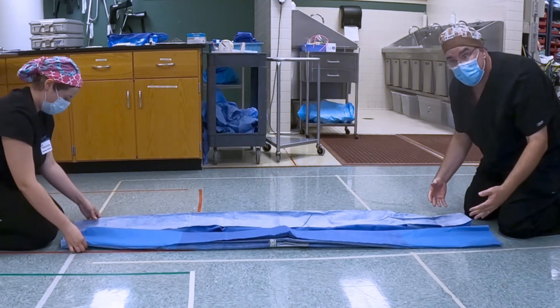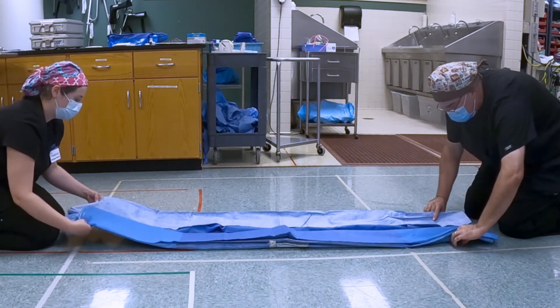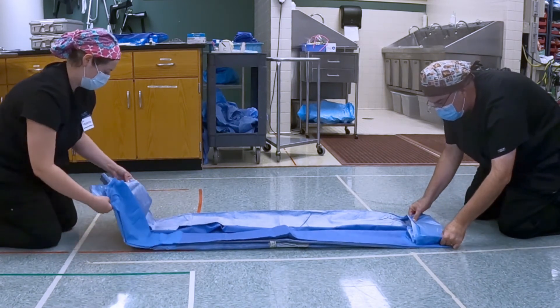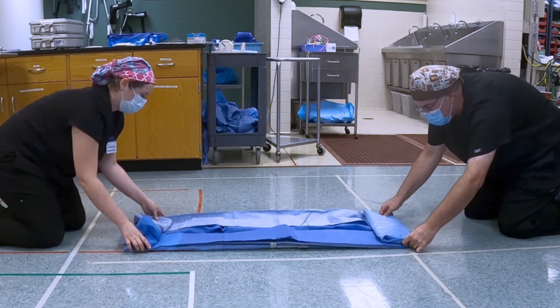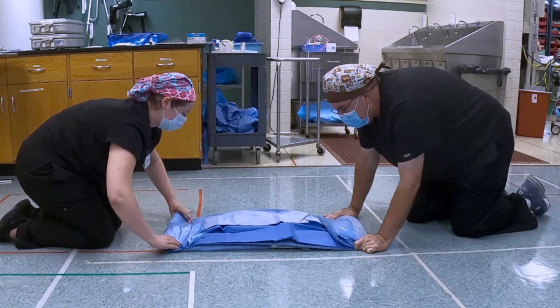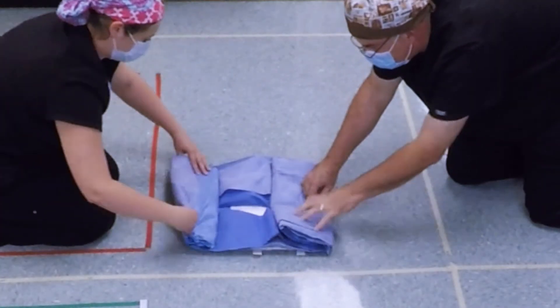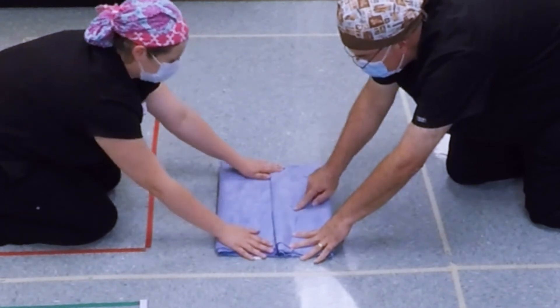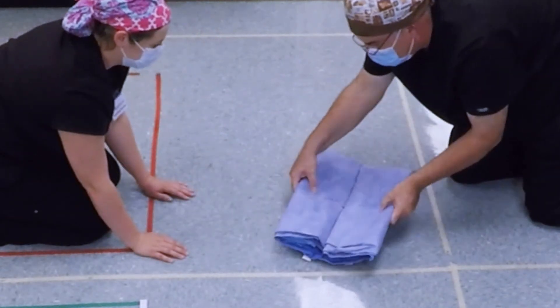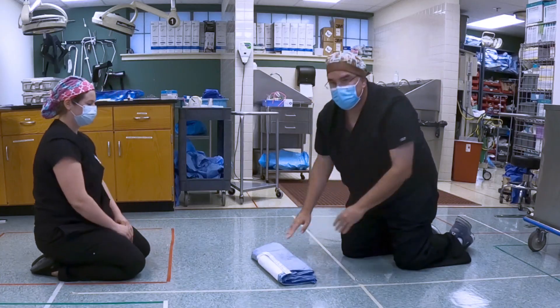Now at this point we're going to simply roll it in. Take this end up, roll in, next one roll in, next one roll in, and one more — roll into the center. I can see my arrow, she can see her arrow, we bring our arrows together — there's our person — and we have a full good lap sheet.